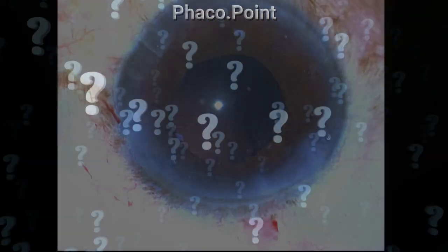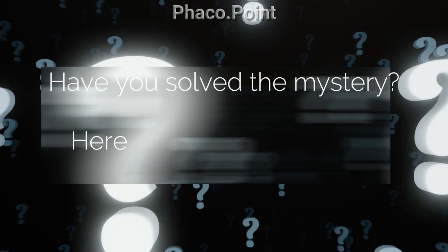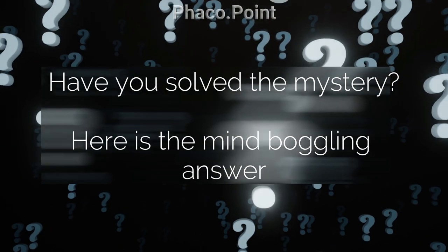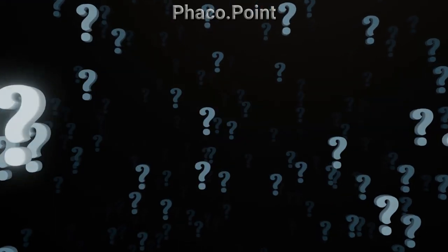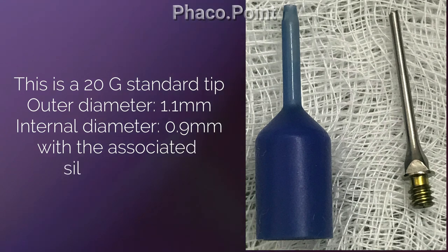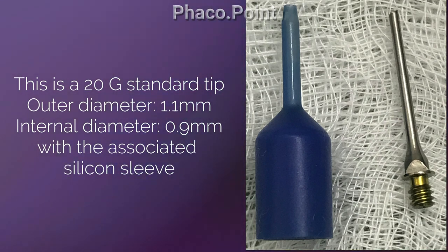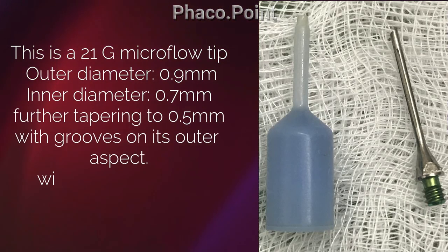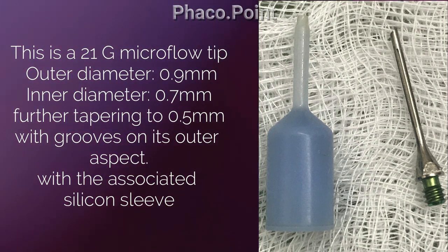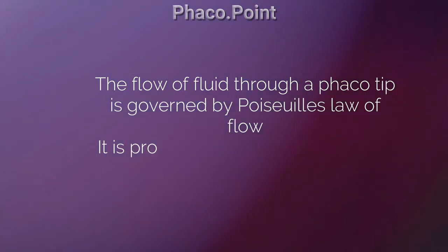Now, dear friends, have you really figured out what could have been the cause for this abnormal shallowing of the anterior chamber? Well, let me give you the answer. This is a standard 20 gauge tip with an outer diameter of 1.1 millimeter and an internal diameter of 0.9 millimeter with the associated sleeve. What we use is a 21 gauge microflow tip, outer diameter 0.9, inner diameter 0.7, which further tapers to 0.5 millimeters. Now, when I asked for a new tip, I was given a standard tip.